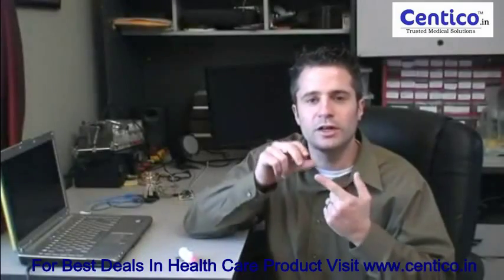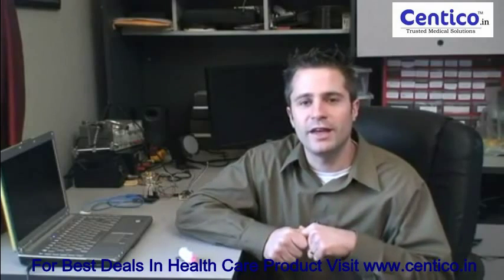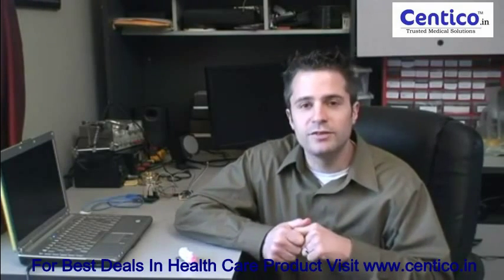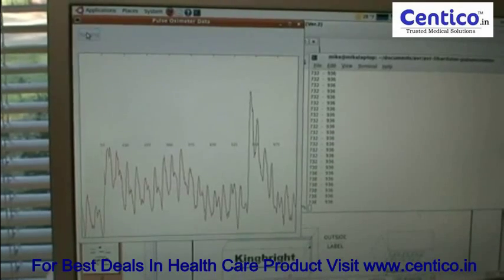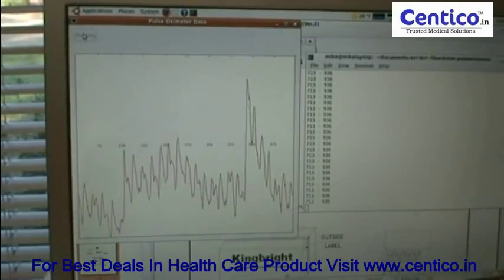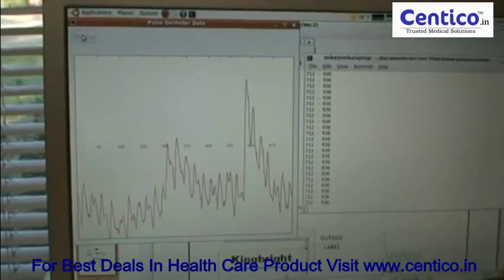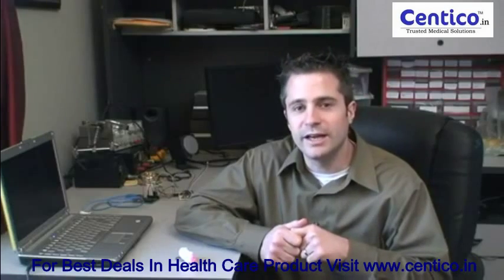Have you ever been to the doctor and they put the little clip on the end of your finger, and from that they can tell what your heart rate is and your oxygen saturation? I decided to figure out how it works by building my own. I'd like to show you what I've gotten so far, which is pretty cool, and then go into detail about how it works.